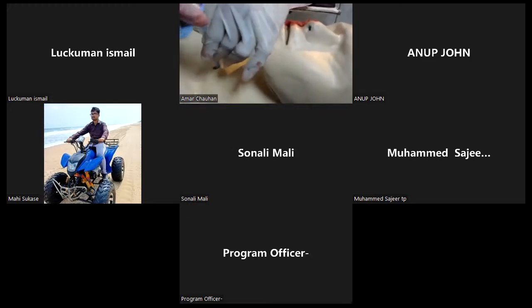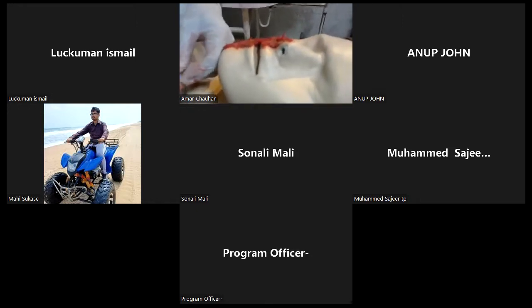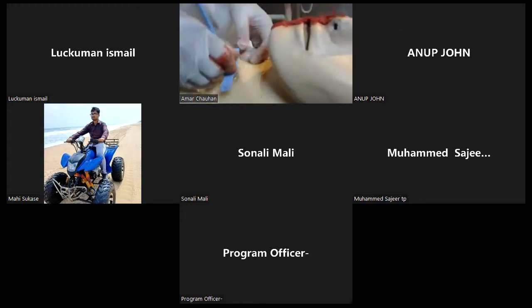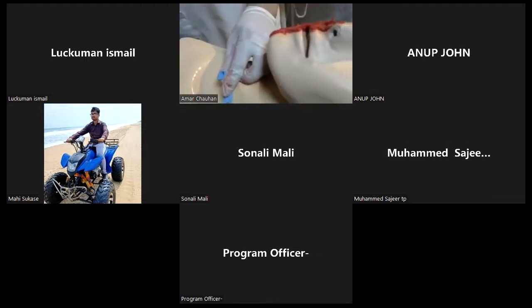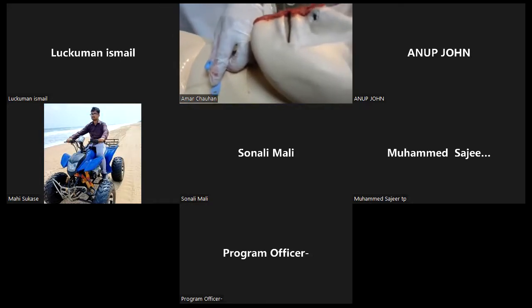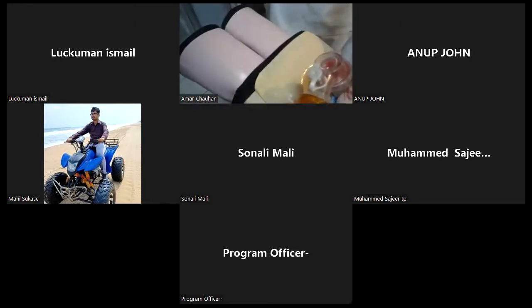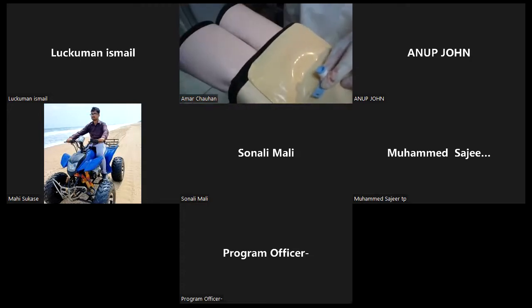This is a very fast procedure because the patient is almost in an arrest state, and the scenario is you cannot intubate, you cannot ventilate. Okay, so now for demonstration of tube placement, we have given lungs also. You can see the lungs are inflating. And furthermore, if you want to further confirm, you can attach a breathing sensor.